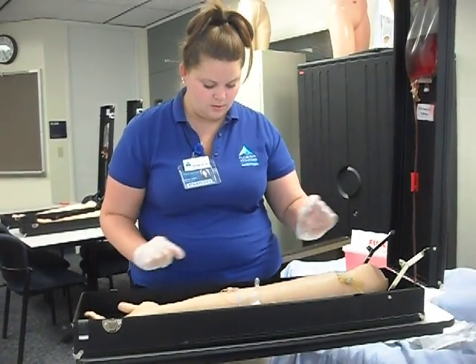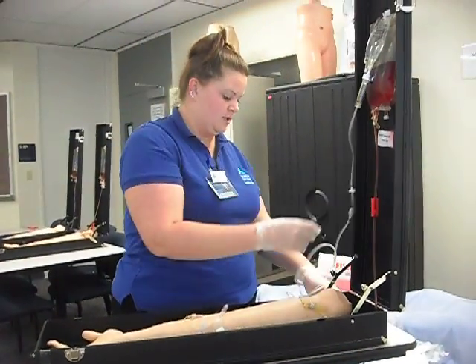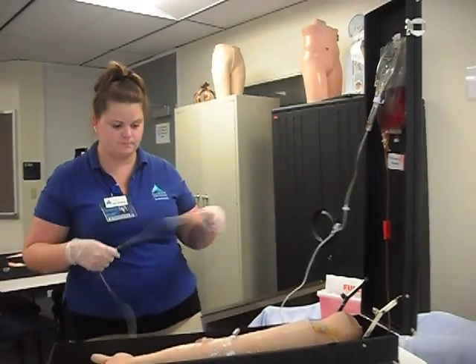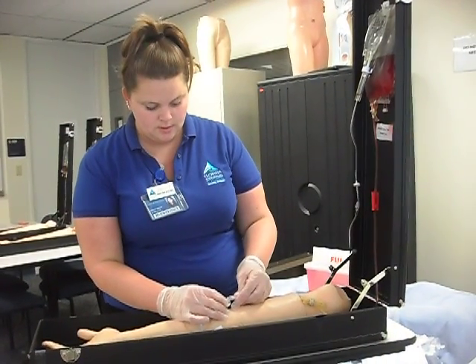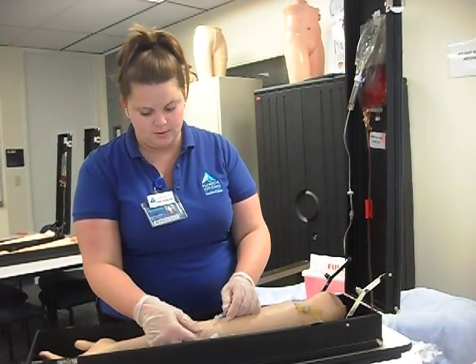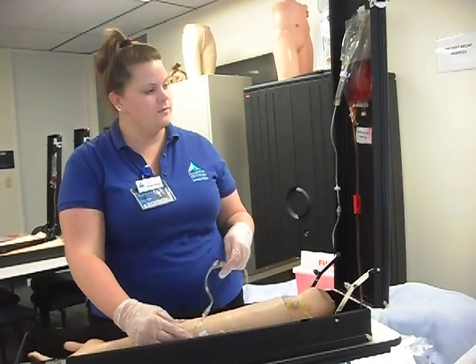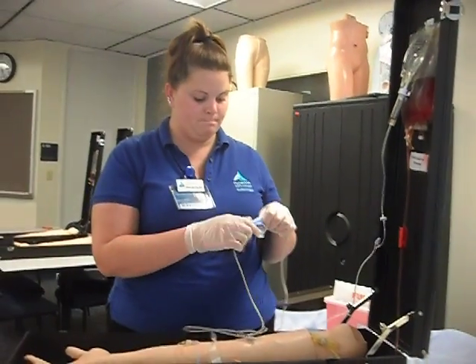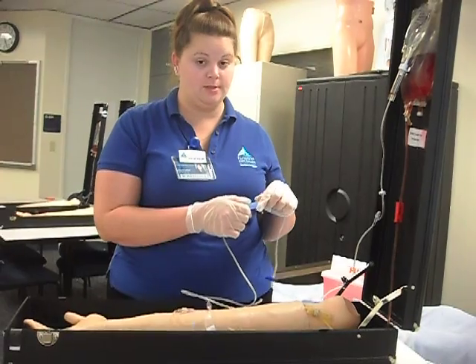And so that's ready. I'm going to take my medication and hang it. Make sure there's no air in my tube. And I am going to connect the tubing and make sure this is unclamped so that it can run through. I'm going to set my drip rate with my roll clamp to the calculation that I previously did.